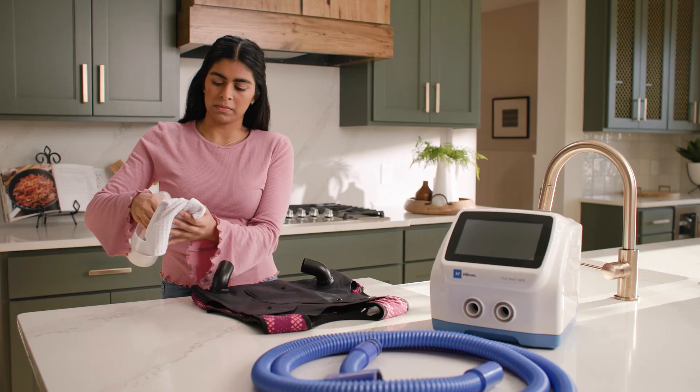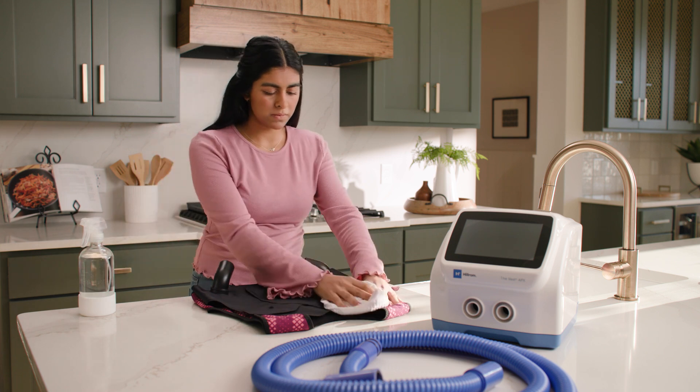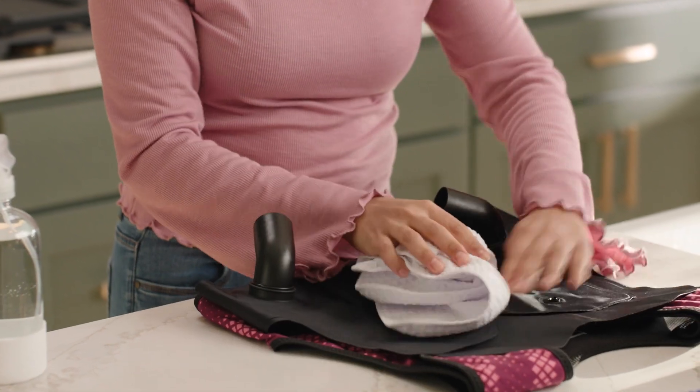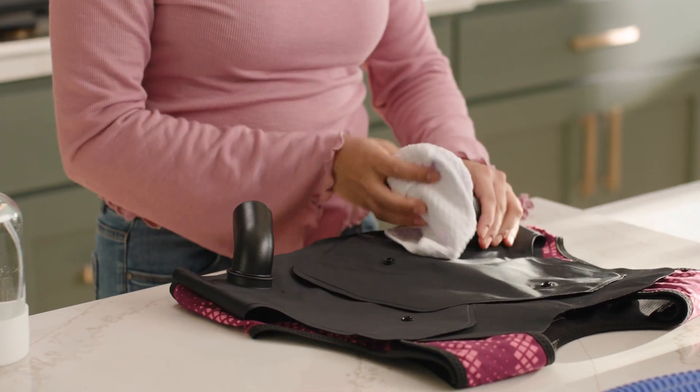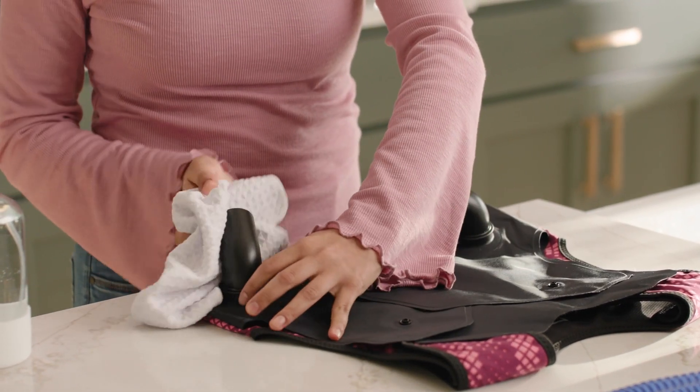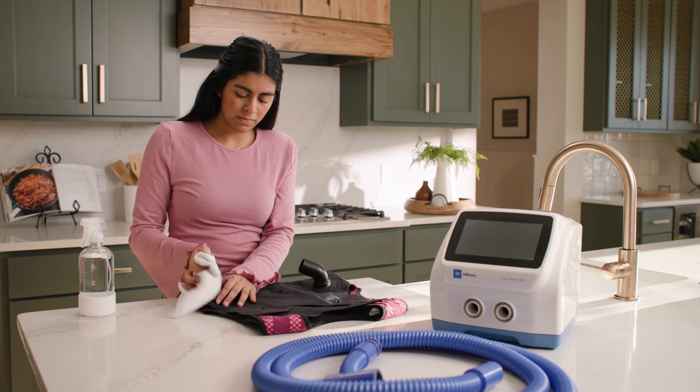Start cleaning the bladder by wiping it with detergent and warm water. Make sure to thoroughly clean the air hose connector port outlets. Do not use excessive liquid or harsh cleansers, and do not put the bladder in water or any solution. Remove any excess liquid with a dry cloth.